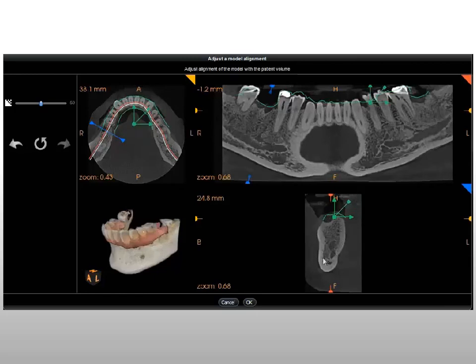To complete repositioning of the model, release the object and click OK. To cancel modifications and exit the Adjust a Model Alignment window, click Cancel.